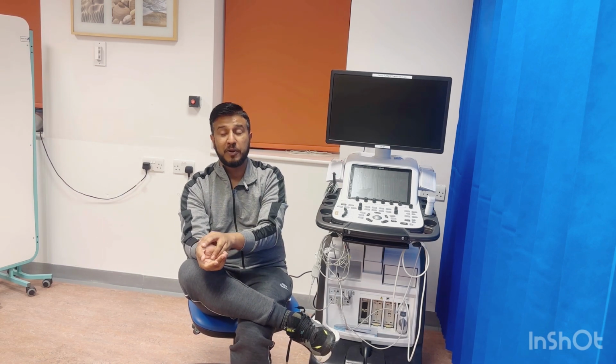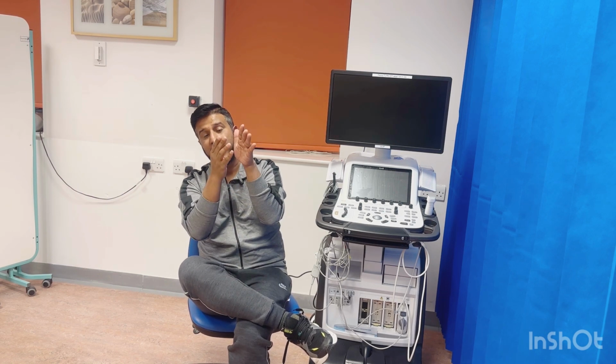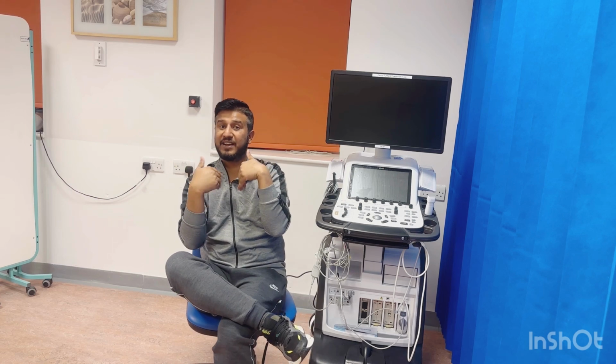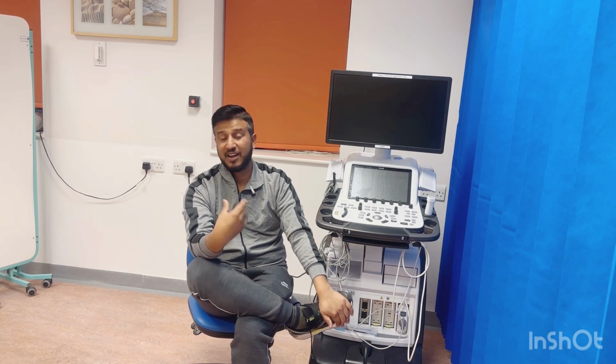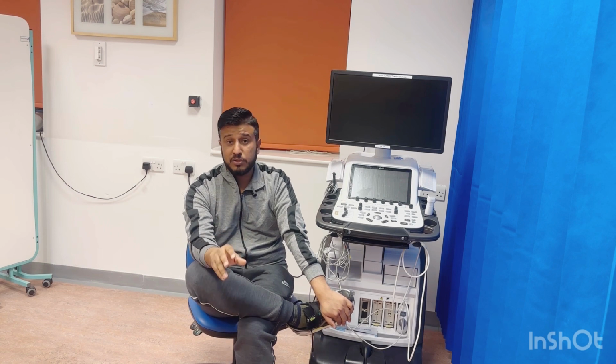Always try to do the Doppler. Even in aortic stenosis patients, always try to take the higher parasternal long axis view on the left side. I'm not talking about the right side. Put the Doppler there. Most of the time you will get the higher velocities, like the right parasternal one. But anyway, this is it. So this is another way.